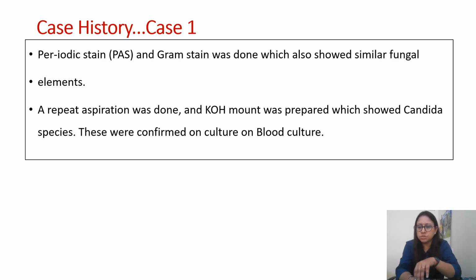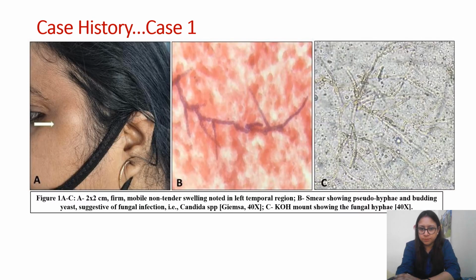A repeat aspiration was done and KOH mount was also done. KOH mount, we do it for fungal stain. I'll show you the picture as well.